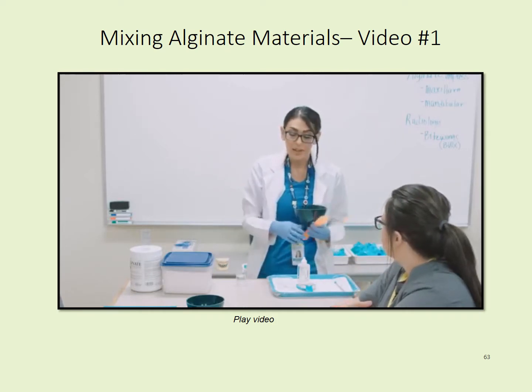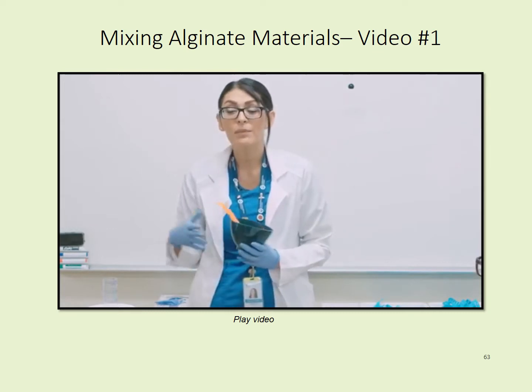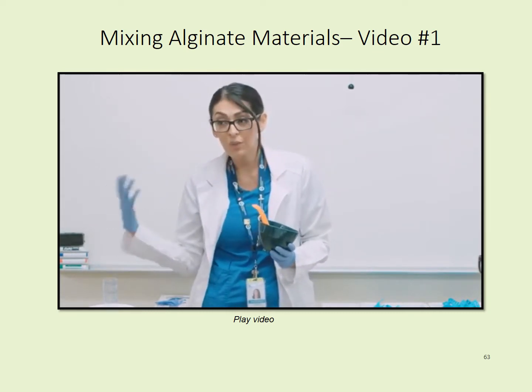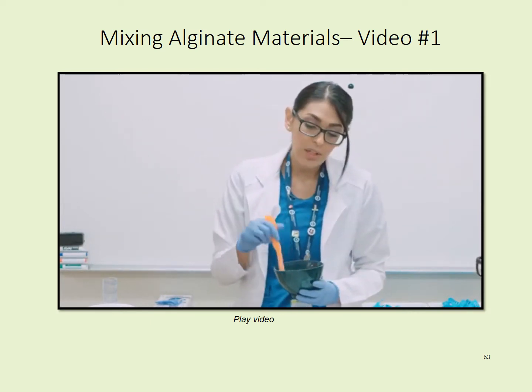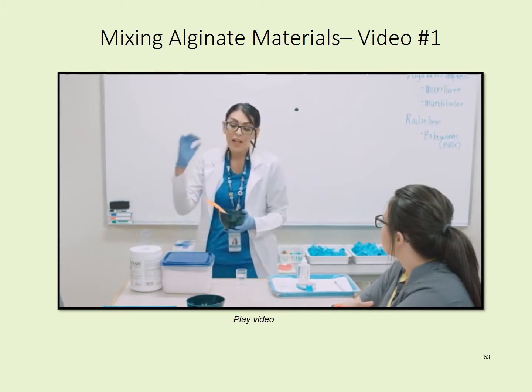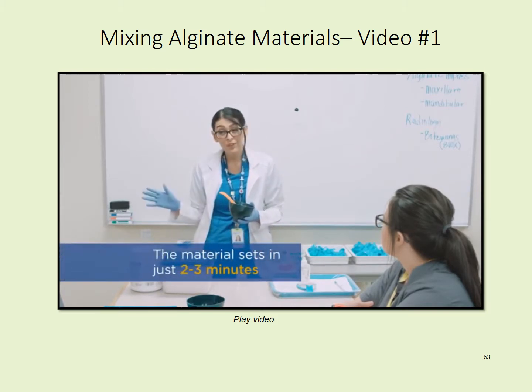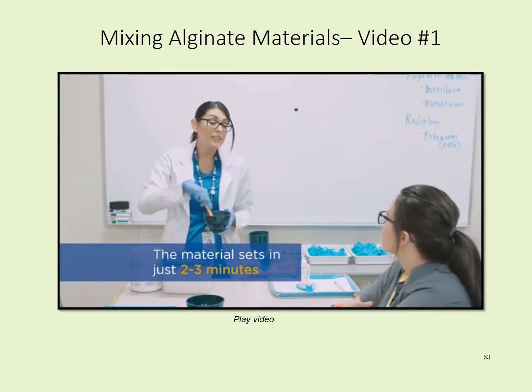and set the tray. Now, when you do alginate impressions, like everything in dentistry, you want to be fast and efficient because we have our patient in the chair waiting, we have a schedule. This particular alginate impression has a fast set, which is this one, and a regular set, which is this one. From the time you put the water in to the time it sets, you have anywhere between 2 to 3 minutes. So once you place this water in the alginate, you have to mix pretty quickly before it starts to set.